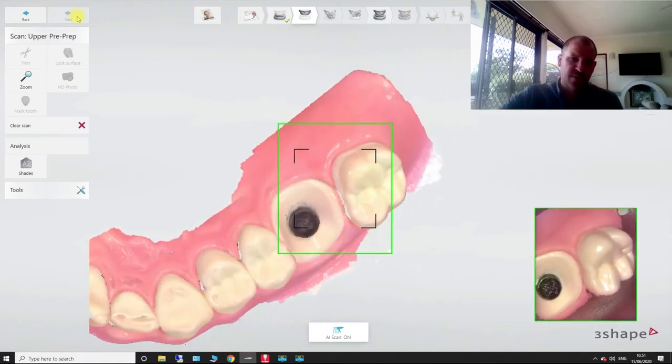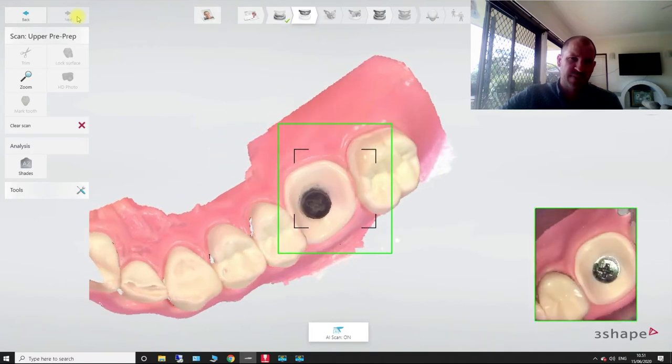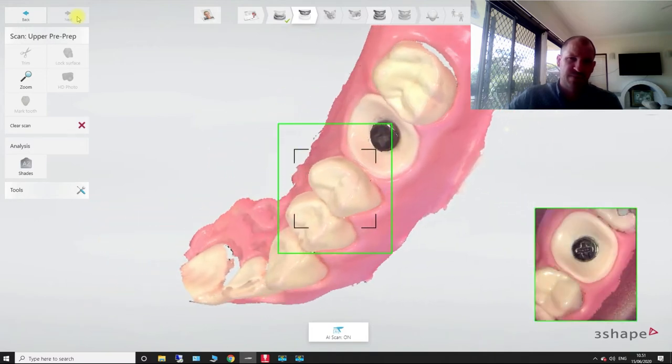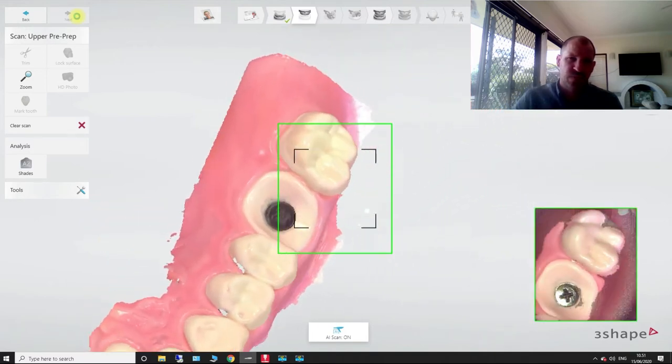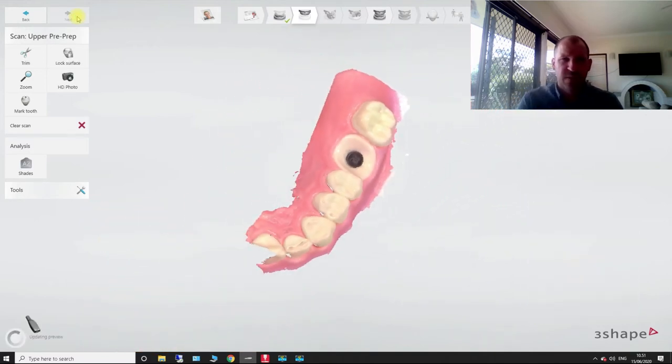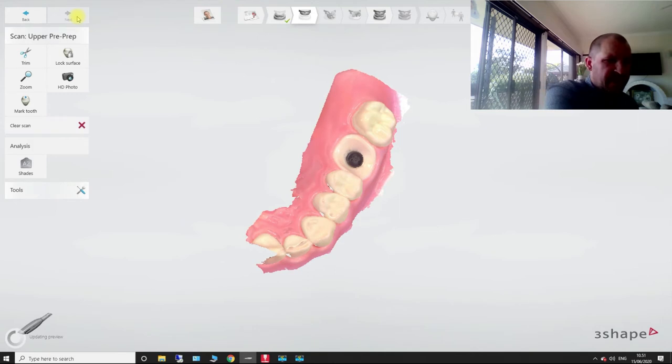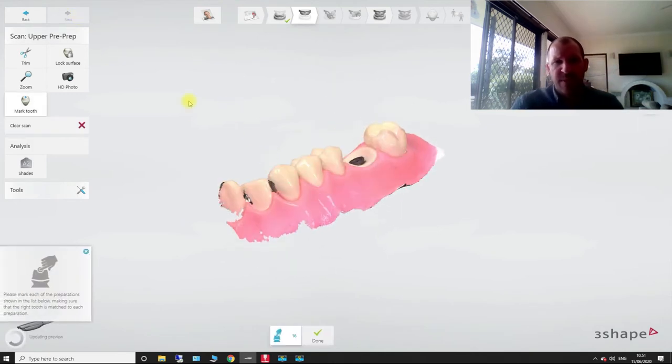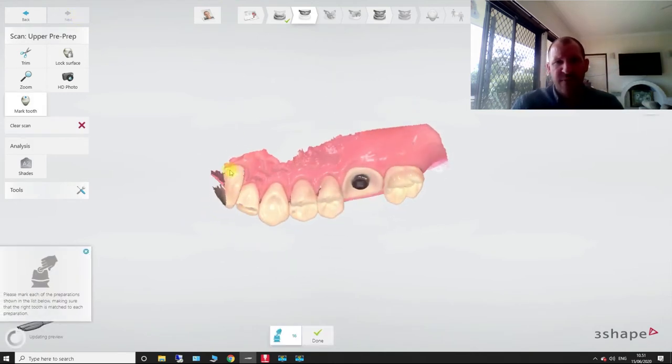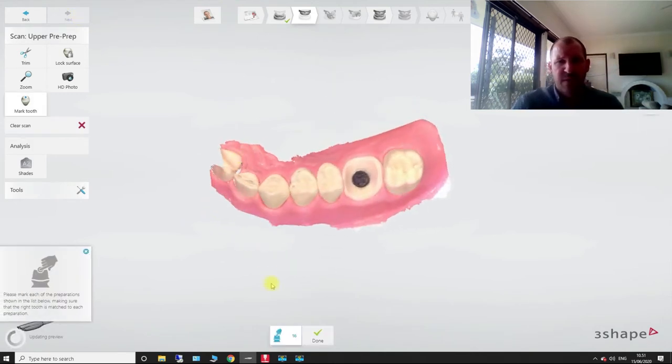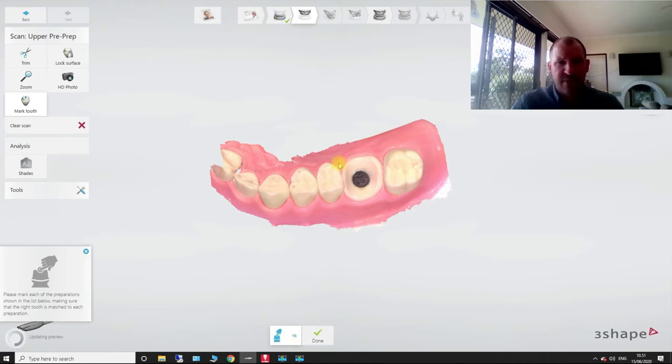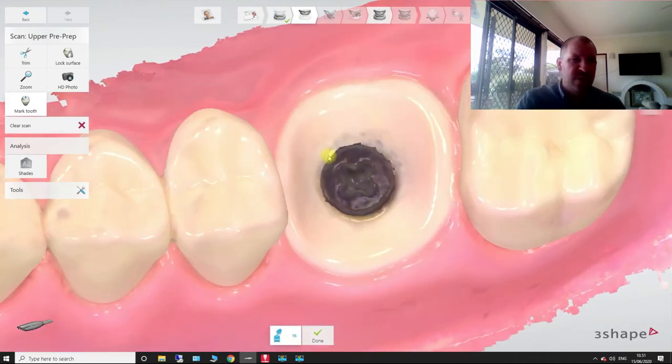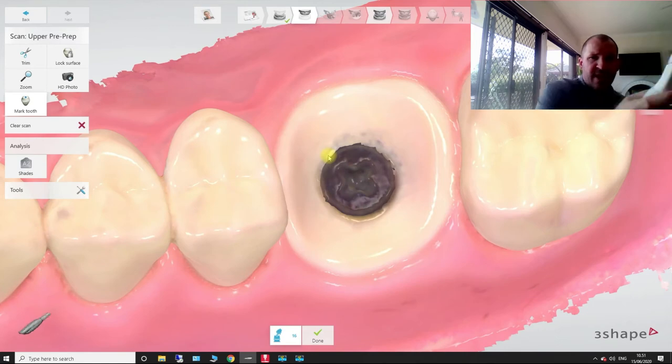So we're going to come across, we're going to pick up our interproximal areas. Alright. So that's our healing cap done. So we're going to pick up this part of the scan first. And you can see here, it's going to ask us to mark the tooth. So we can do that with the scanner.